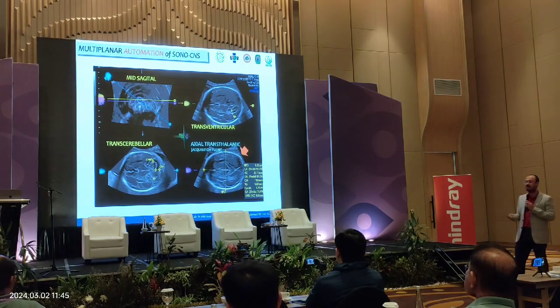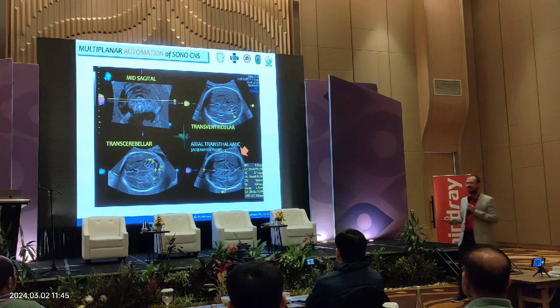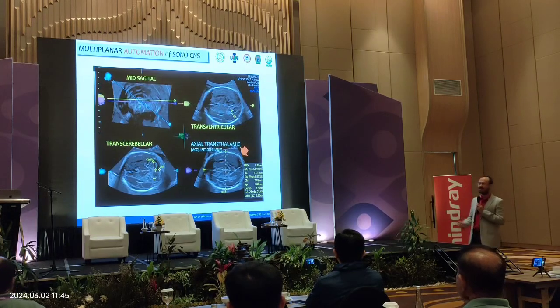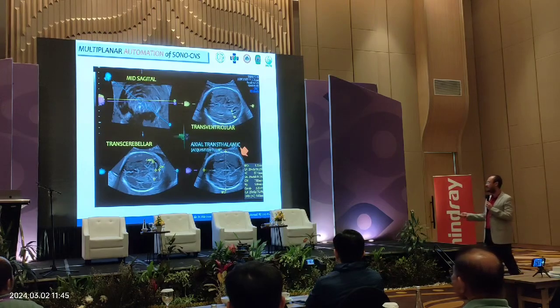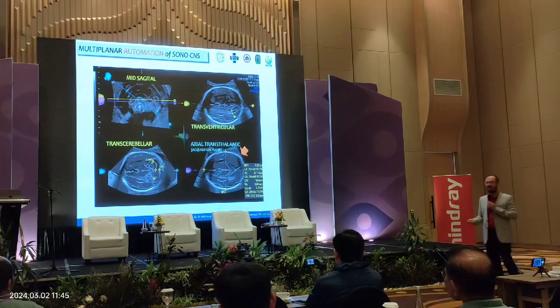And maybe later on AI can also measure the angle of the Sylvian fissure. Maybe Leona's team has already made AI for measuring this, for the CNS, not only the cerebellum and then the cisterna magna and posterior ventricle. The angle also comes out directly, automatically.